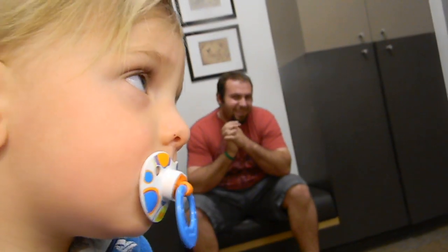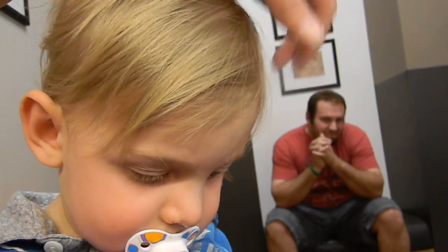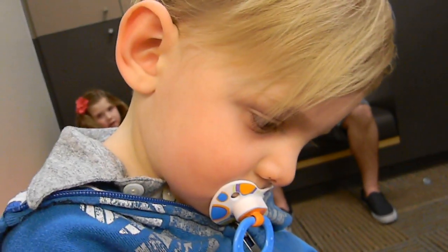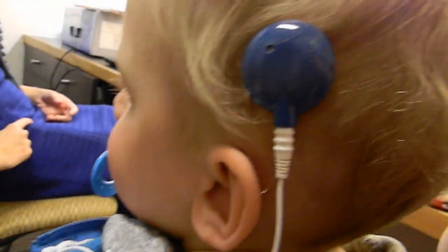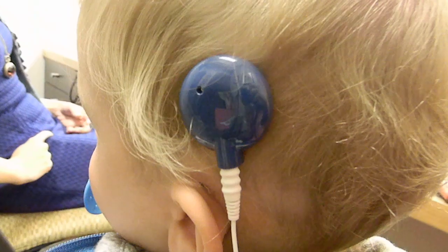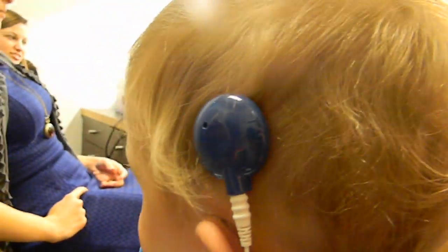So that's just connecting with the — it's not a speaker so he can't hear us. He cannot hear us, he's just hearing stuff on the computer. That thicker white wire that's plugged into that cap — that's plugged into the processor, or into the computer. I'm really curious about what's happening. So it's working, right? It should be. So what we're doing — this is the same test we do in the OR.